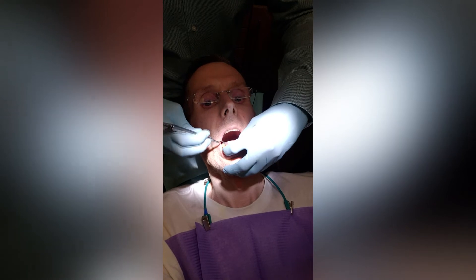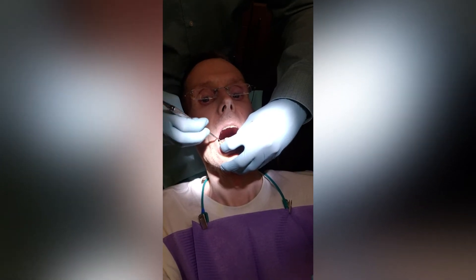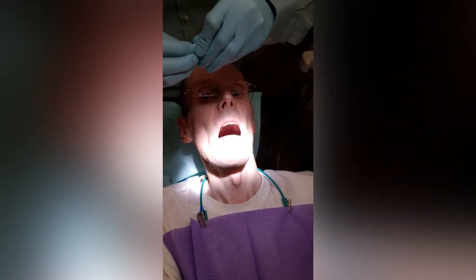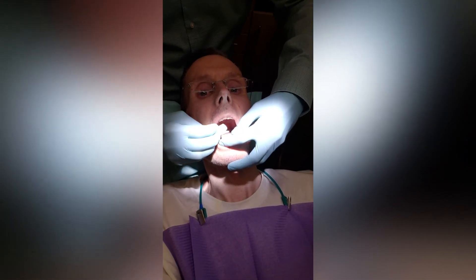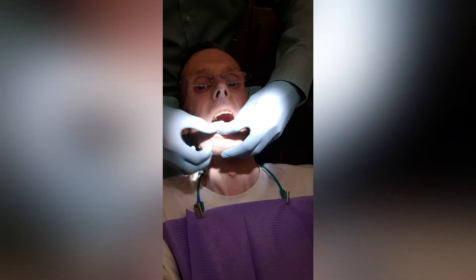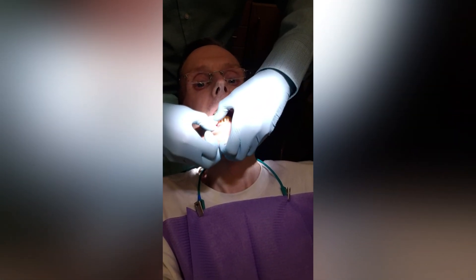Out of those risks we talked about, too much bleeding was one risk, and I don't think we'll be flirting with that at all. We've got a nice amount of bleeding — maybe a little bit less than what's average. So this is just a bit of gauze; I only used one piece. I rolled it up and I'll stick it there so you can close and have a little pressure on that.